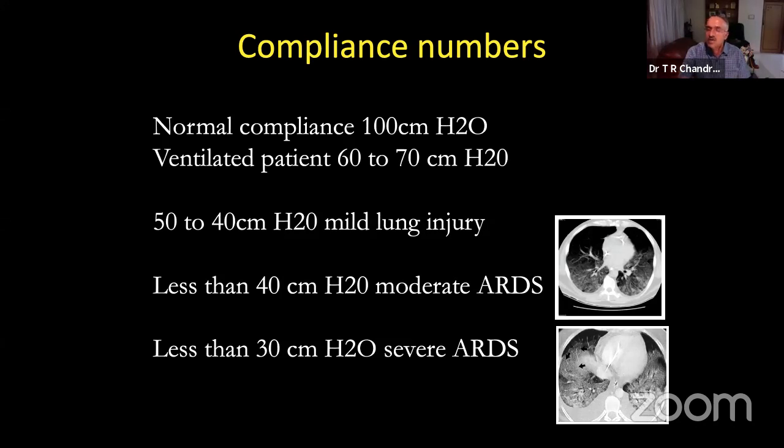He will come and teach you. Just press it for 1, 2. Just count 1, 2. Just press and leave. The plateau pressure will come. Then in the future ventilators, even the driving pressure comes. Driving pressure is nothing difficult to estimate.